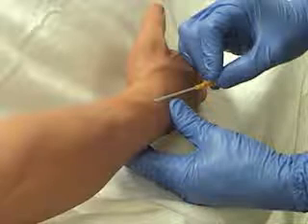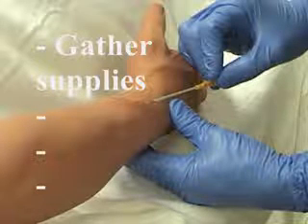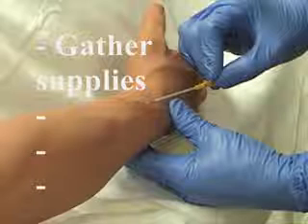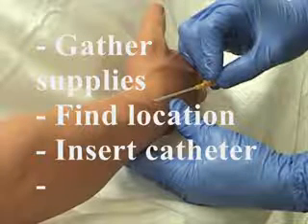Let's review. When starting an IV, you should first gather all of the necessary supplies and arrange them so they are easily accessible. Take your time and find a good vein. Go by feel, not by sight. Insert the catheter using your dominant hand, securing the site with your non-dominant hand.